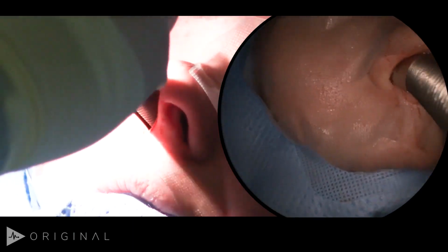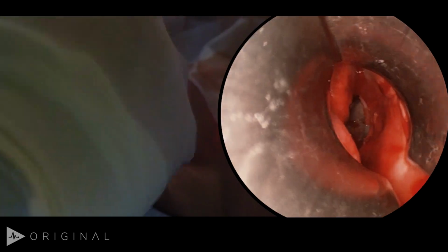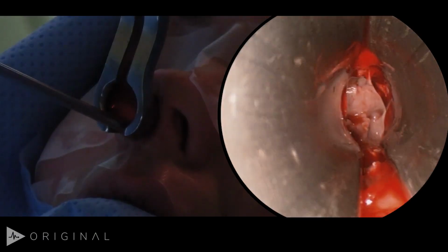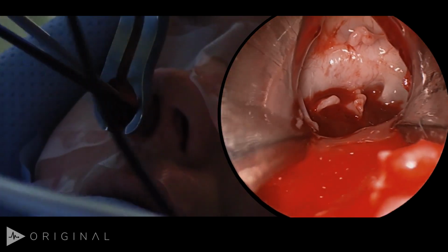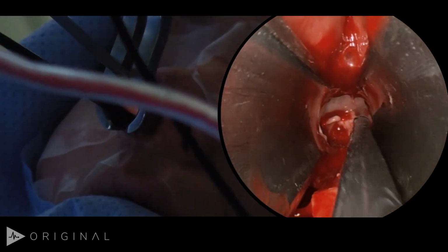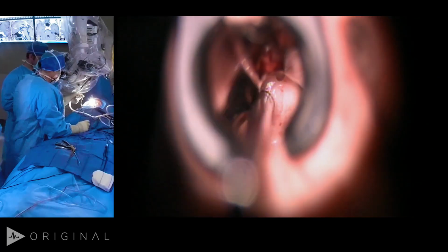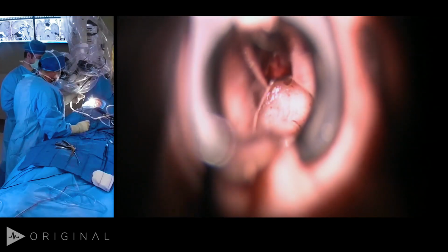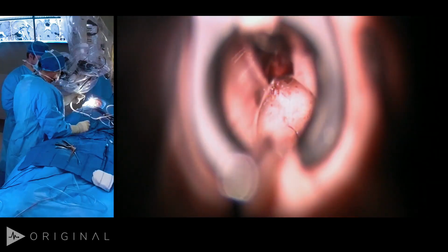This nasal speculum typically put in upside down this way. It's usually a fairly tight fit. You want to track a path back to the sphenoid and have a good angle towards your sella. That's the exposure that we'll be working with for the case. And certainly if it ends up being suboptimal, we can always take a little bit more bone out laterally or superiorly. So we have a very nice exposure of the sella. This is the patient's left side. That's the right. In the midline, we've confirmed verbally whether our ENT surgeon is right about here.